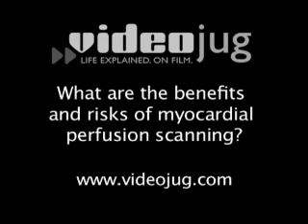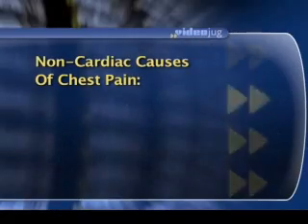What are the benefits and risks of myocardial perfusion scanning? The benefits of myocardial perfusion imaging are tremendous. Basically, it's a very time-tested procedure for accurate diagnosis of coronary artery disease in patients. So that's the major benefit for us to establish which patients, for example, who are presenting with chest discomfort actually have cardiac origin disease as opposed to other causes of chest discomfort.